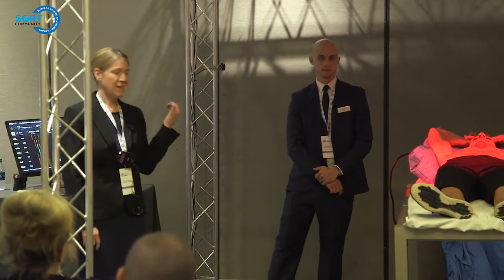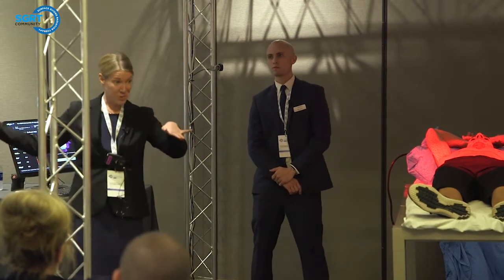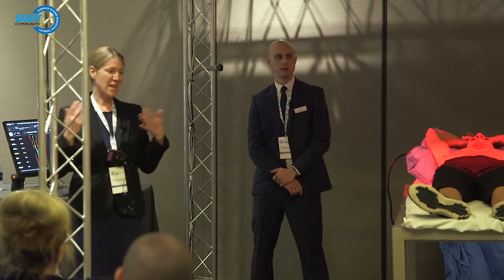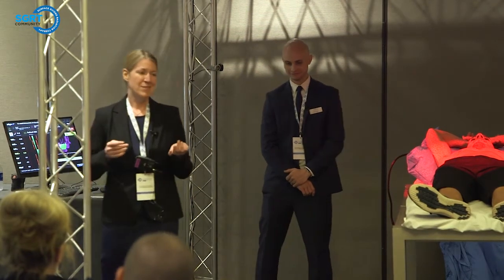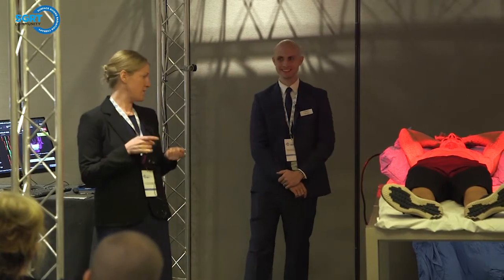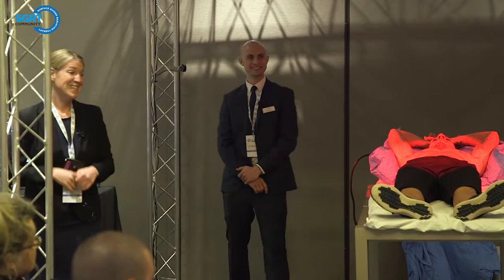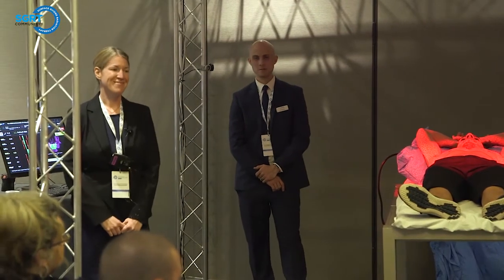So what he's saying is, on site, I'll go in, we'll put a phantom on, and then we'll move it, like vert, lat, long, and see which way it goes, and just document it. So everyone makes a quick cheat sheet of which way to go. Yeah, make your own. We're in the process of creating some, actually. You don't have it. Correct.